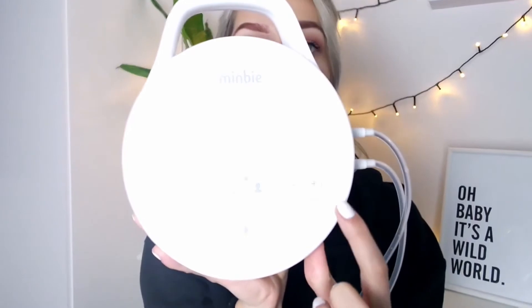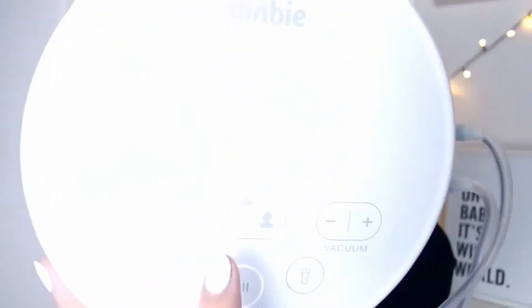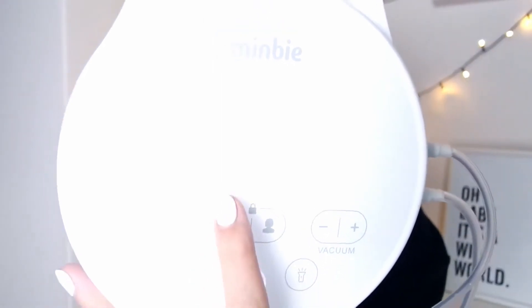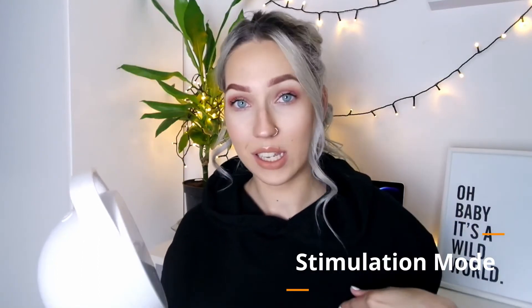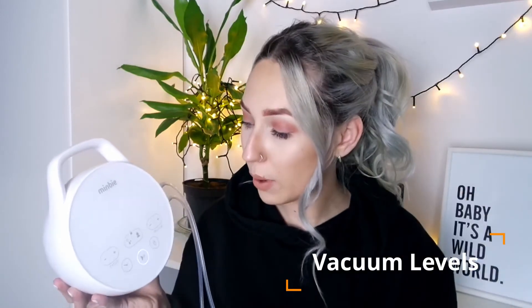You've got your settings where you can adjust the cycle and the vacuum. It is super easy to switch between different expressing modes — your stimulation setting whenever you first put the pump on so that your breast gets stimulated and your milk starts to flow, and then with just a touch of the button once you feel your let-down, you can set it to longer, slower sucks, which is what a baby would normally be doing.